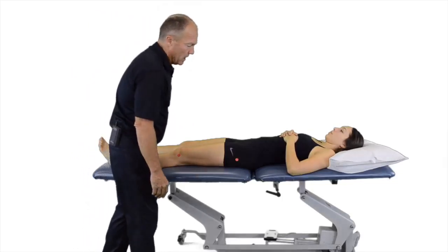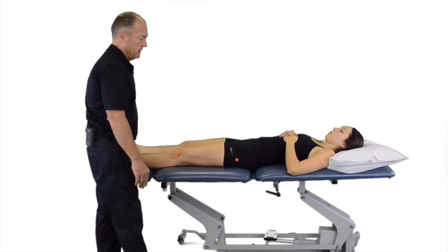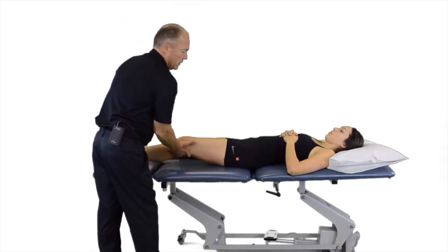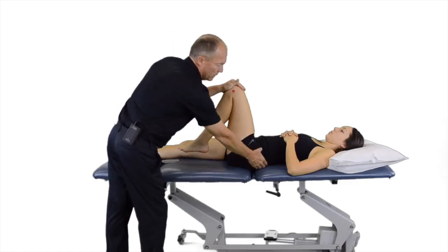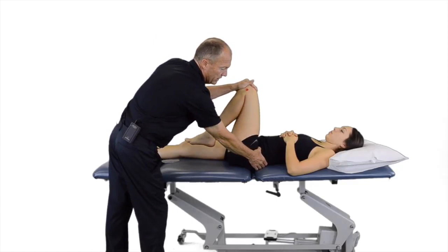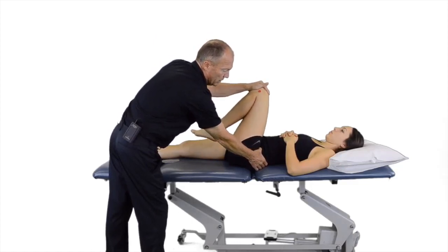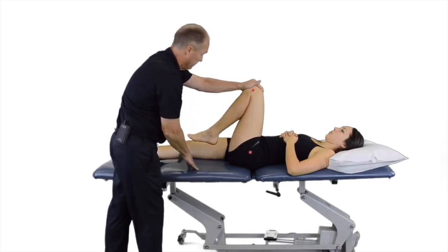With the patient now lying in supine, we are going to take a measurement for hip joint flexion. In this position, we would flex the hip forward, allowing the knee to relax, and I would palpate at the pelvis, specifically the iliac crest, to look for posterior pelvic tilt. At that point, that would indicate the end of hip joint flexion.